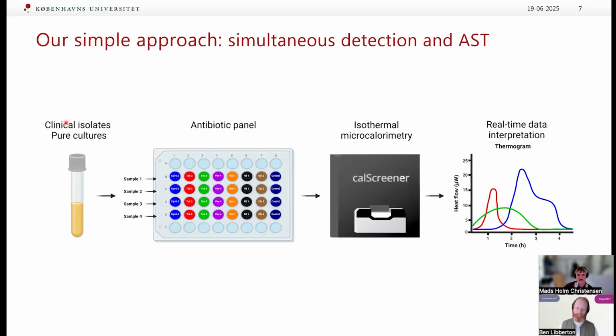Here, if you can read the numbers and the letters, was a panel I decided to use because it covers some gram positives and some gram negatives, and some of the species most often found in osteomyelitis infections.